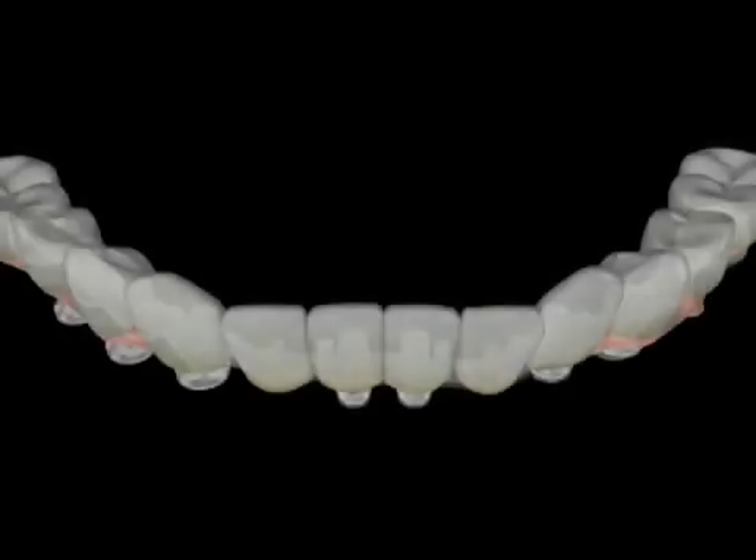The teeth are veneered and any cosmetic soft tissue additions are completed. The prosthesis is then finalized and is now ready for delivery.